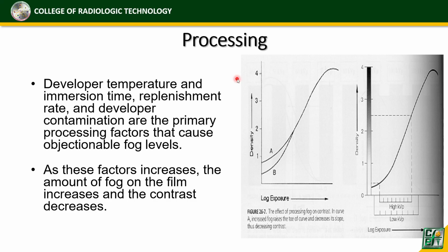Tandaan nyo pa? Ako hindi nakanda. Balikan. I-review yung temperature, humidity, dapat ay huwag makakalimutan. Balikan. Okay? So, ibig sabihin, sinasabi lang na itong mga factors na to sa processing ay makaka-apekto sa production ng fog sa film.